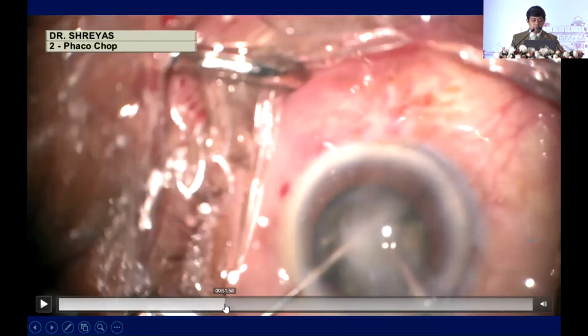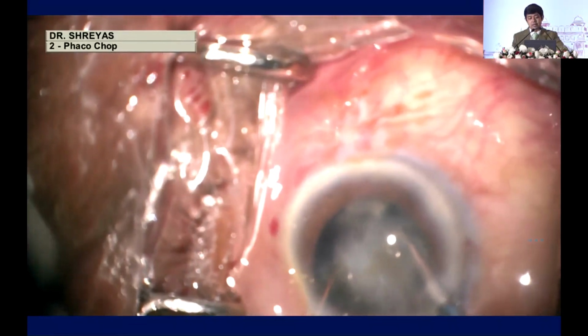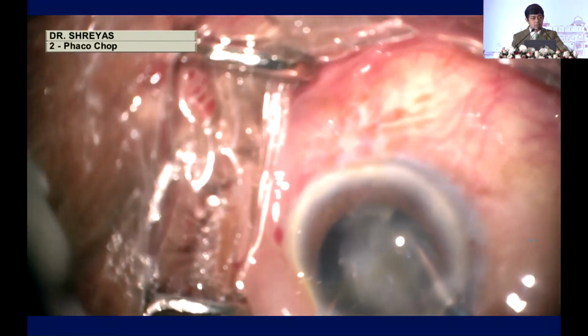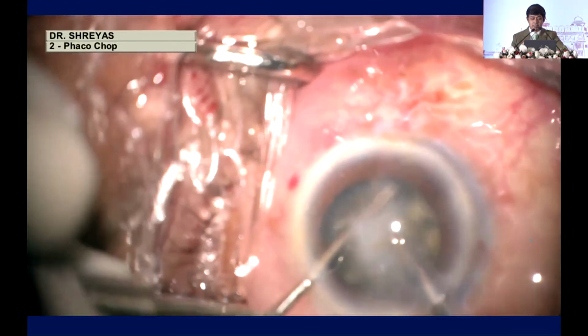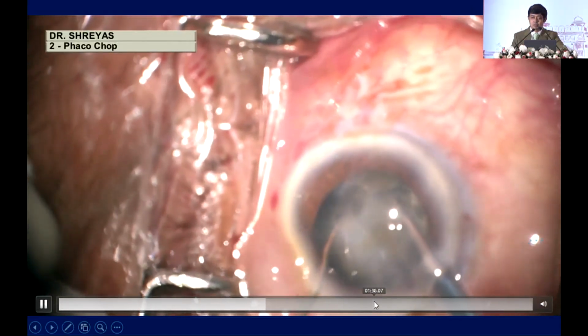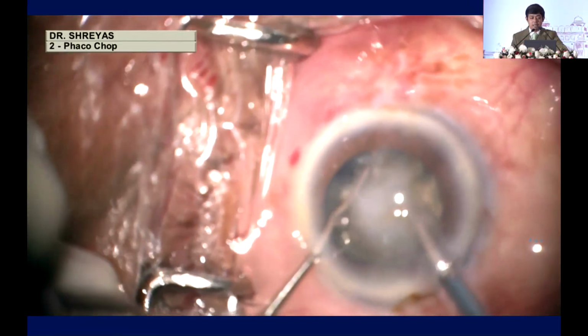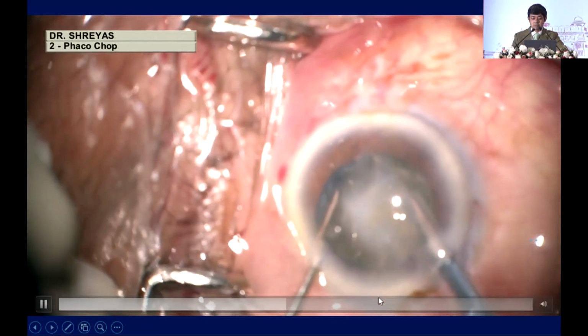And all I'm doing here is ensure it's a hard cataract, but tilt the globe into the area where you have visibility, do multiple sub-chopping maneuvers, ensure that the chopping has been completed before you do the emulsification procedures, because if you try to remove the nucleus and you end up damaging the capsule, managing a ZD with poor visibility becomes more difficult.